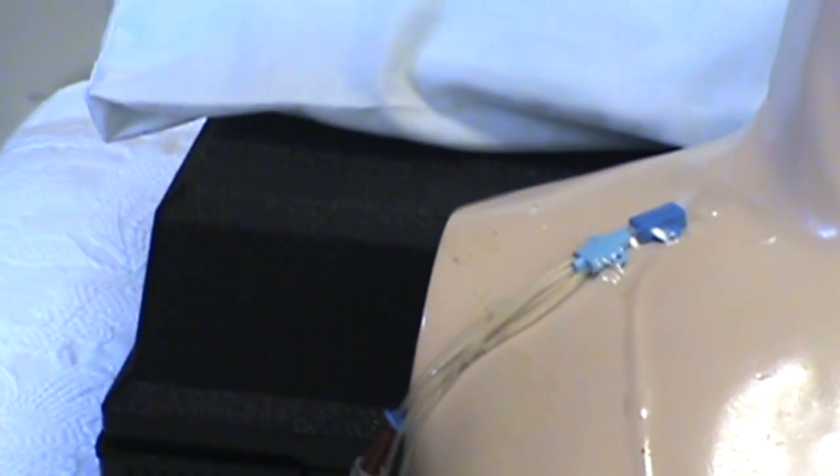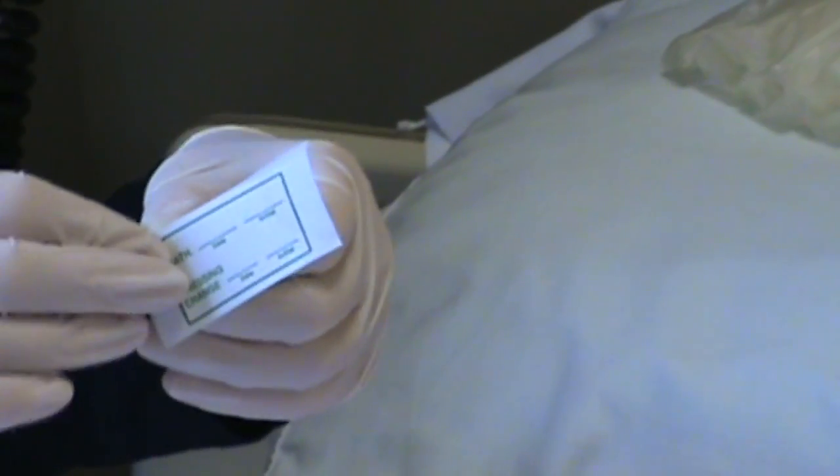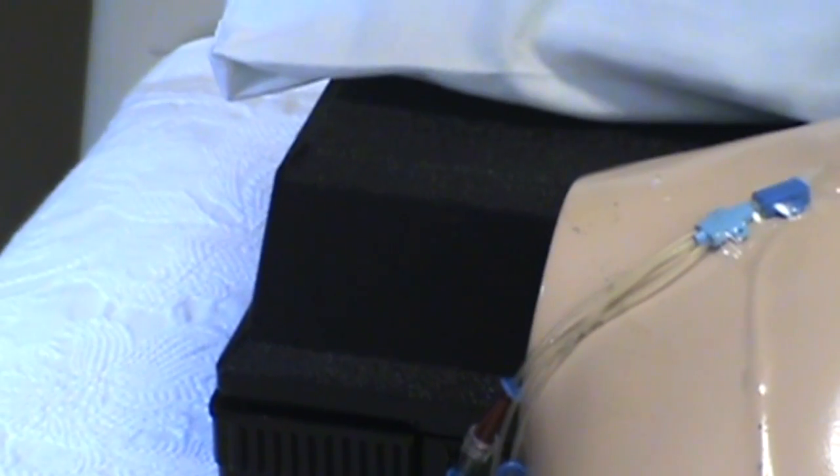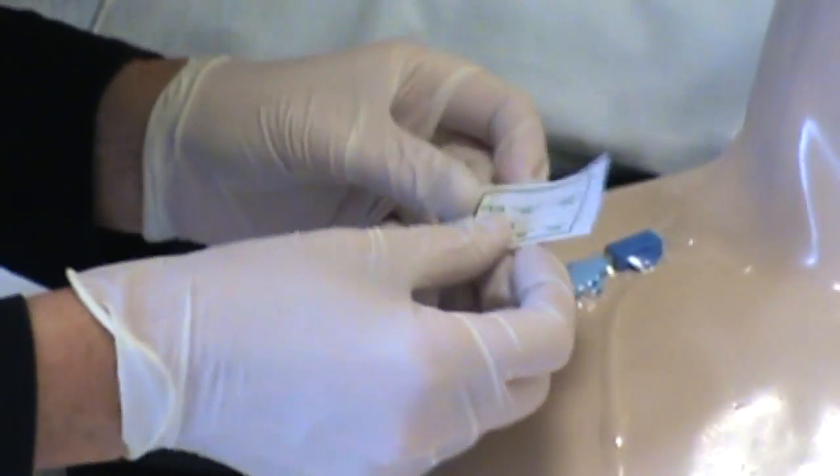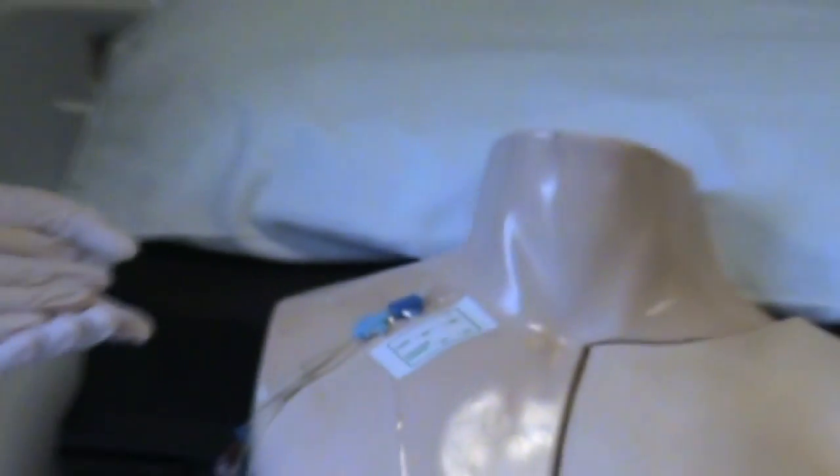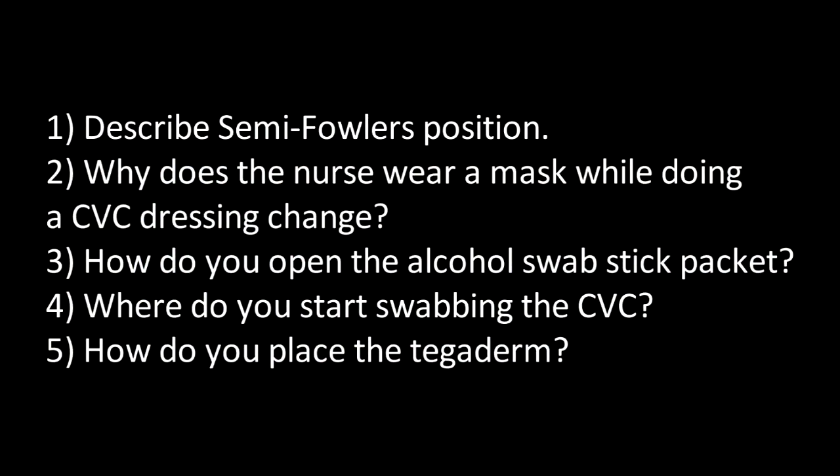Throw that away, and then you have a little label here that says your name and the date and the time you changed it. Go ahead and fill that out and then peel that off, and then stick it on your tegaderm, not over the site but next to it, so the next person can see when it was last done. And that's all to changing your CVC dressing. See if you can answer these questions.